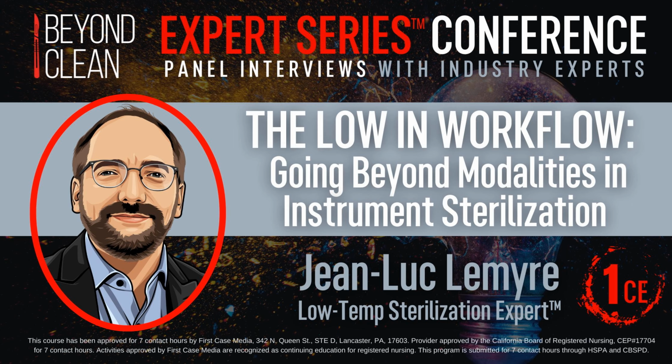So if it absorbs it, I guess there would be less to go around for the rest of the chamber, and then it'd be hard to evacuate it afterwards. Yeah. Okay, that makes sense. Anything that may react with the peroxide and make it less available for sterilization efficacy in a sterilizer is problematic. Yeah. Okay, well, let's talk a little bit about hydrogen peroxide in a sterilizer then.